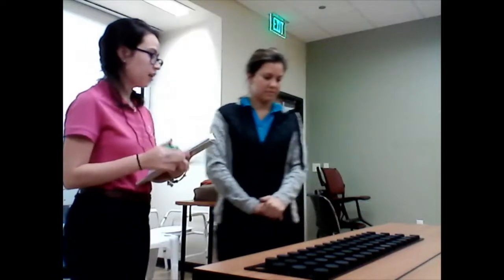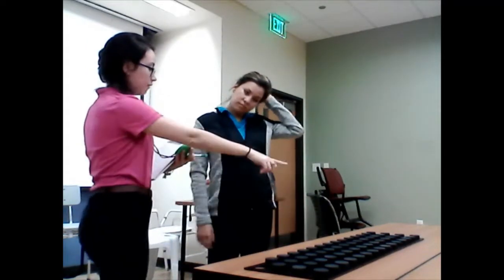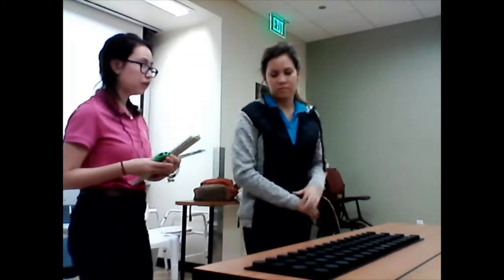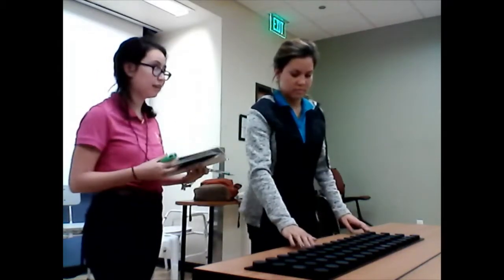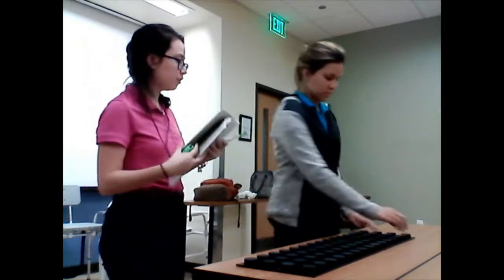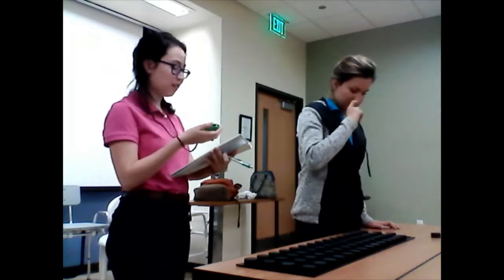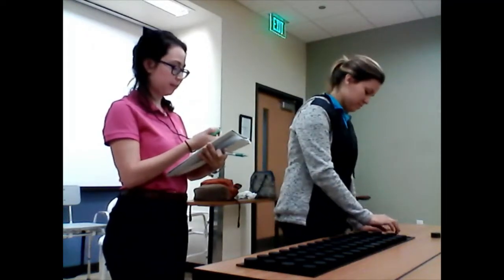Good job. Now you're going to fill the lower right hand hole with the left peg on the top corner. We're going to do this activity one more time. Remember to do it as fast as you can as I am timing you. Please place your hand on the left side of the board, and on the count of 3, we're going to begin. 1, 2, 3.